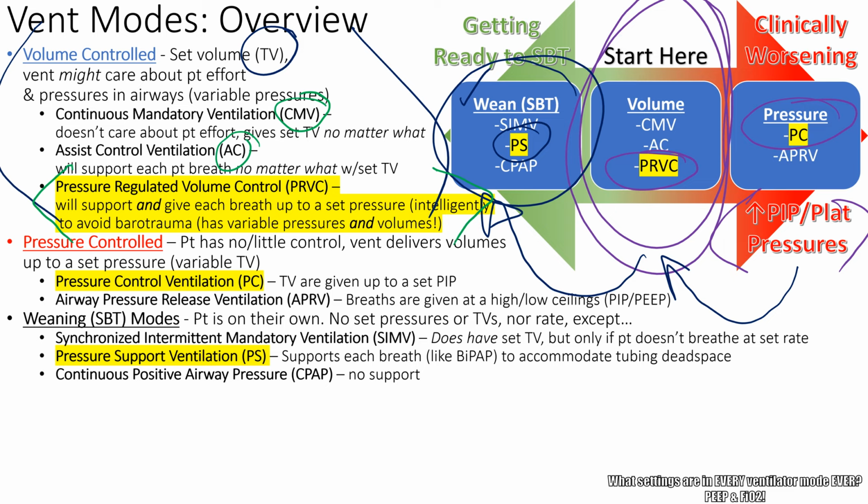They come in there, you say you're doing a bed bath, they see you're laying flat, you see you got a big patient there with ascites, hepatic hydrothorax, and they got this and that side, they got bilateral pneumonia. Let's go ahead and raise the peak pressures to 40. That way they get some volumes during your bed bath, right? And then when you're done, they're going to go back in there and they can set the pressures back down, right? Just like your patient's going to AFib RVR, it's in the 140s, you give diltiazem, you bring it back down, you're going to bring your heart rate alarm back down to where it should be, right? The same situation. So PRVC is a great mode in that respect, in that you can set a high pressure limit, whereas you can't do that in CMV and AC.